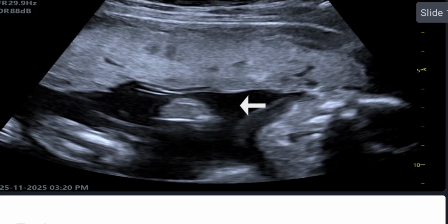All right, here is another sonogram showing placenta anteriorly and pockets of the amniotic fluid that one cannot outrightly say is adequate by just eyeballing.